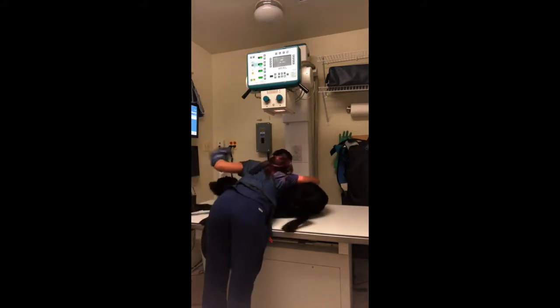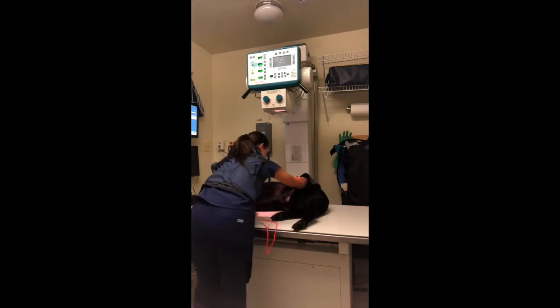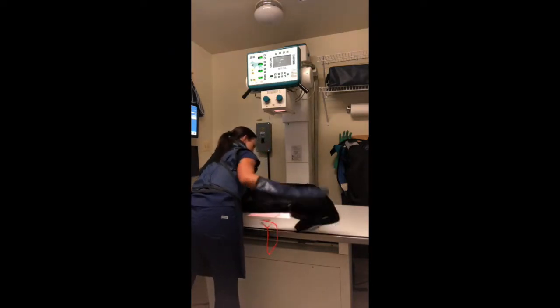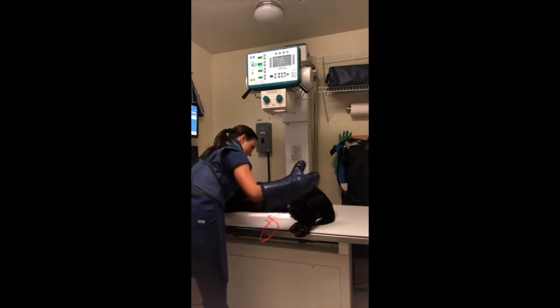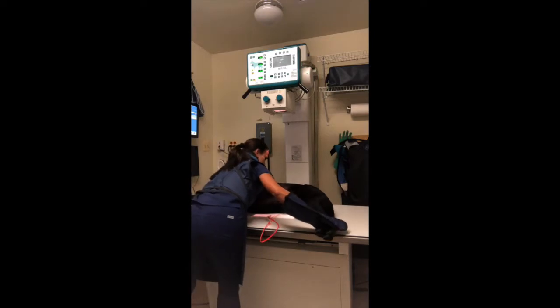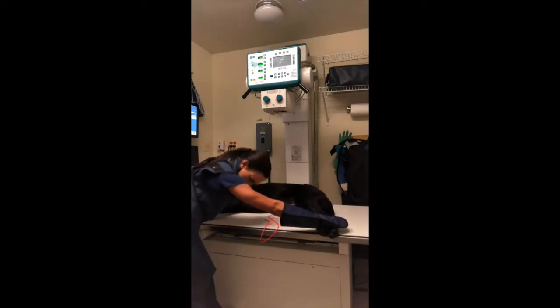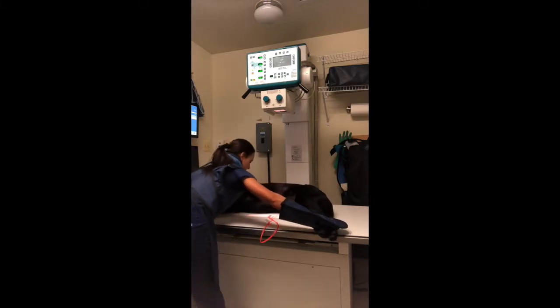Last but not least, in comparison to BIPS, barium sulfate suspensions, which are used for routine GI contrast studies rectally or orally, are not used if GI perforation is suspected. The pros include low cost. It coats the mucosal walls well. It's excellent opacity. It remains in suspension. It doesn't become dilute with secretions. It does not absorb through the intestines, and it has good density.